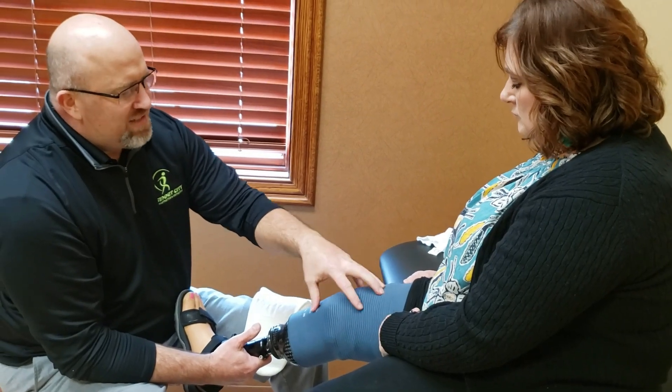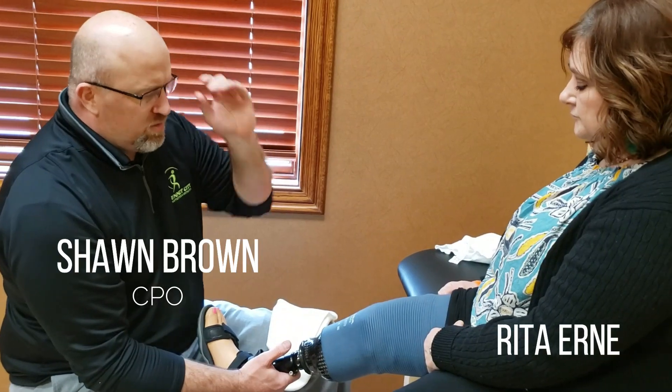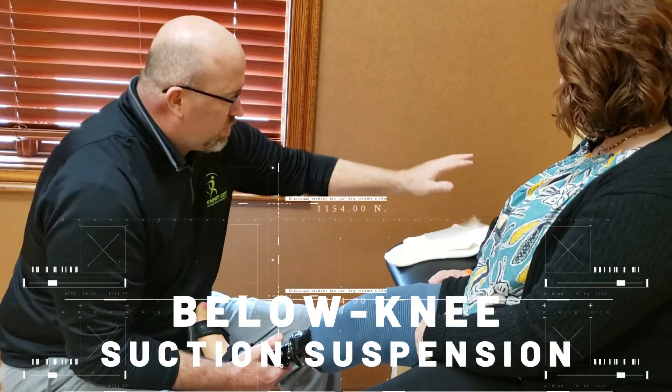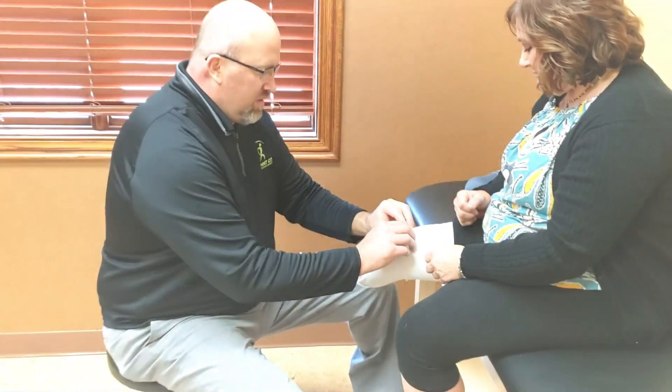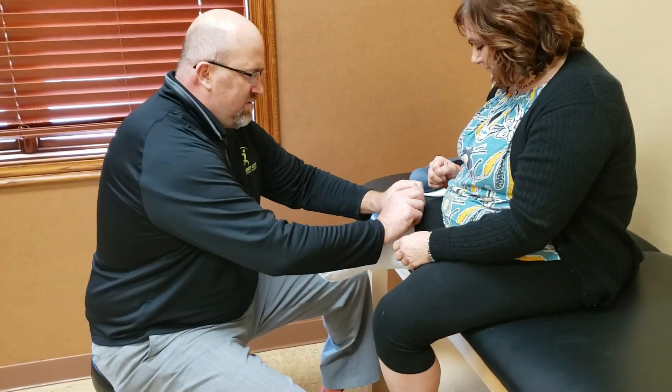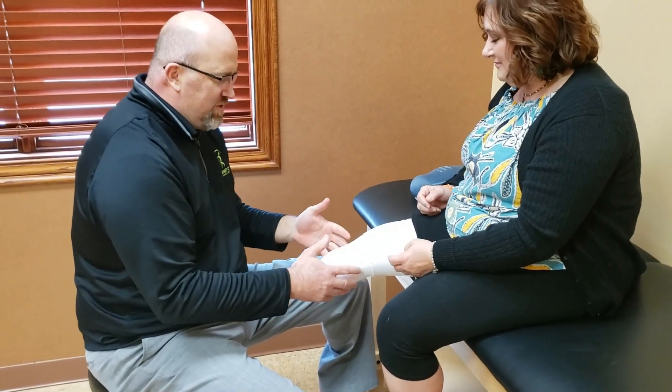In this video, Summit City prosthetist Sean Brown and our friend Rita discuss the basics of below-the-knee suction suspension. Today is delivery day, and we think this is one of the more exciting days.